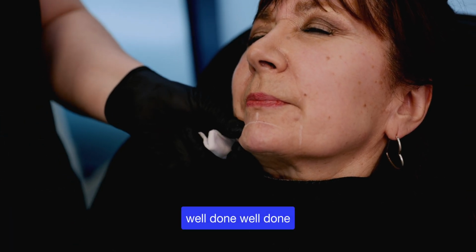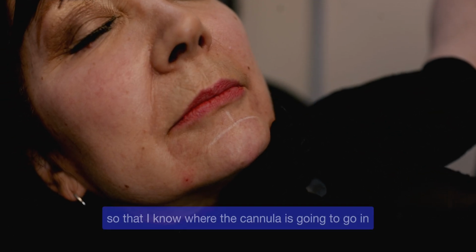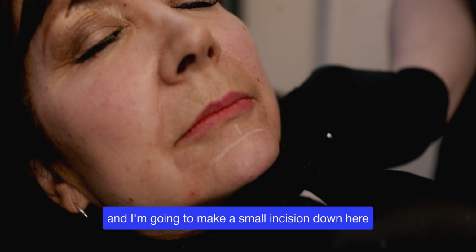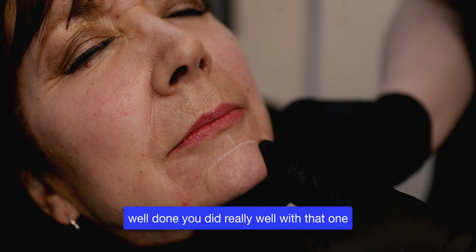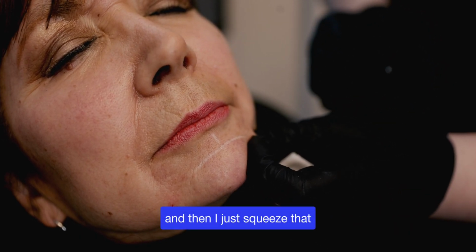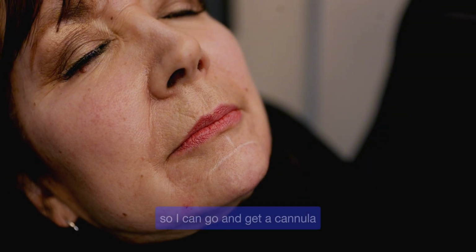Well done, well done. I'm lining up the marionette line with this angle so that I know where the cannula is going to go in, and I'm going to make a small incision down here just to allow the cannula to feed through. So sharp scratch, my lovely. Well done, you did really well with that one. Give it a little wiggle. And then I just squeeze that so that I can see where my last entry point is, so I can go and get a cannula.